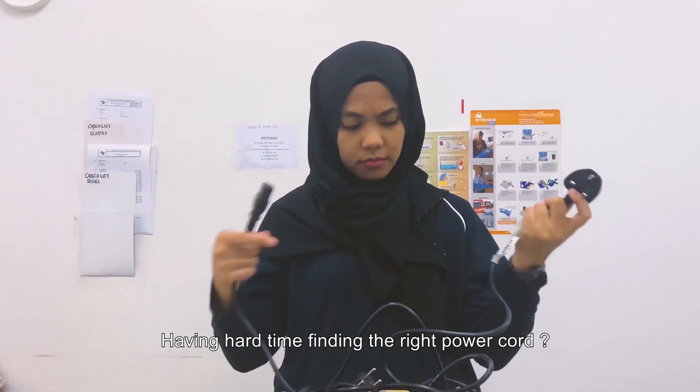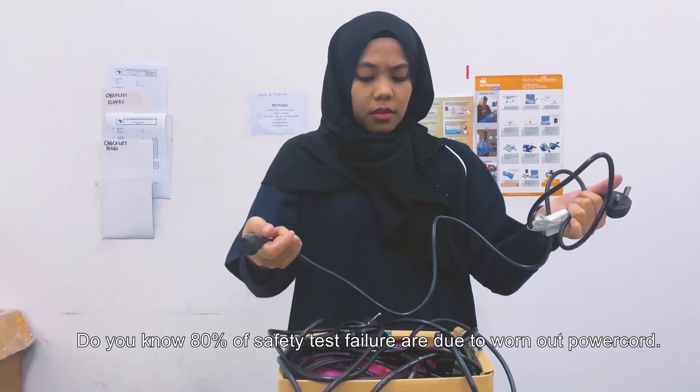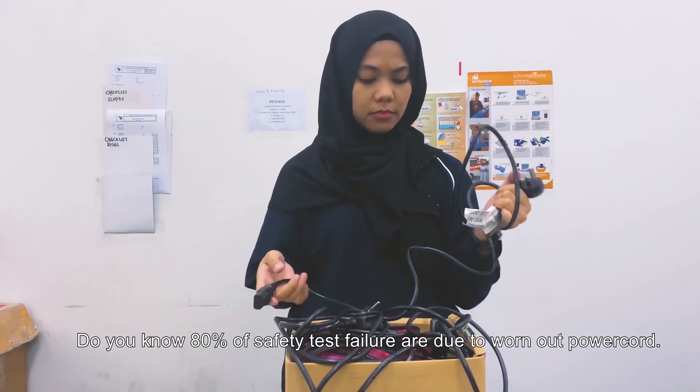Having a hard time finding the right power cord? Did you know 80% of safety test failures are due to worn out power cords?